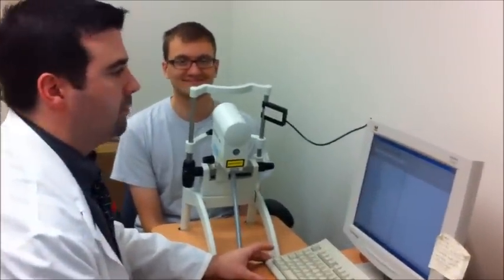This is Dr. Quaid, and this is Mike Peterson, and he's going to show us how to work the HRT.